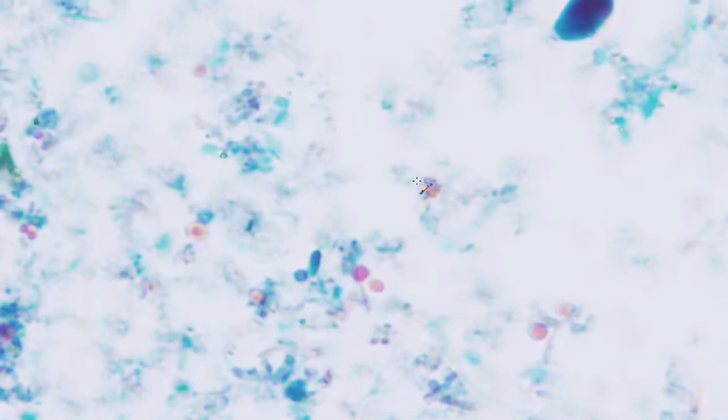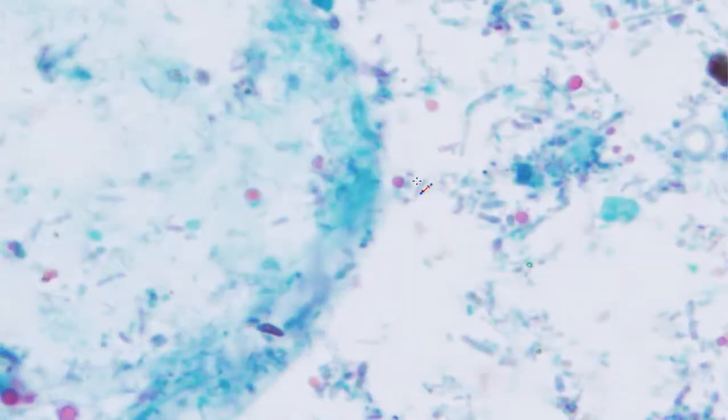So Entamoeba hartmanni is on average 6 to 8 micrometers. It can vary from 5 to 10 micrometers, but normally 6 to 8, and looks like an Entamoeba histolytica. So let's see if we can find some more in here. These are mainly trophozoites in this slide, but I'm going to show you some cysts shortly. I used to see this a lot in refugees from Sudan and Sierra Leone. So hartmanni is quite common in sub-Saharan Africa. It's found throughout the world, of course, but quite common in sub-Saharan Africa.